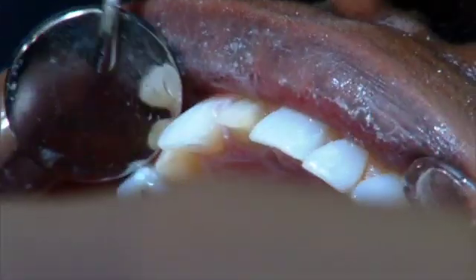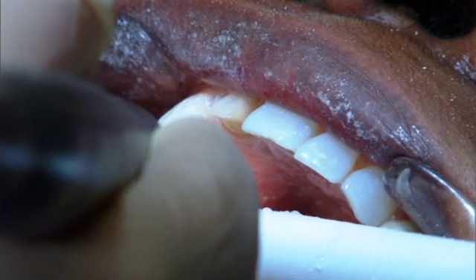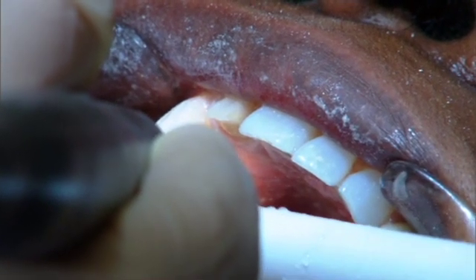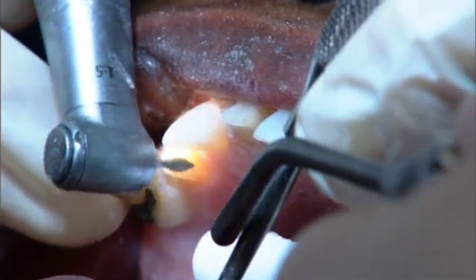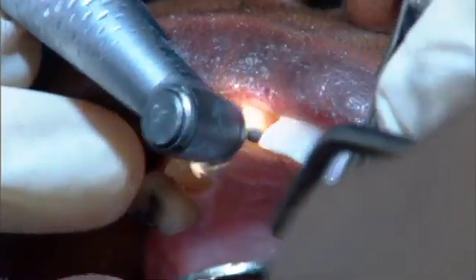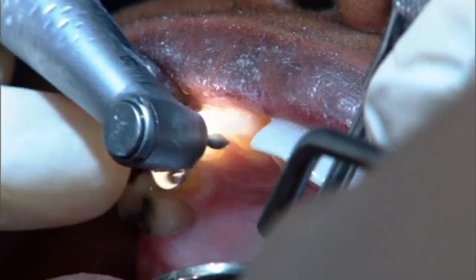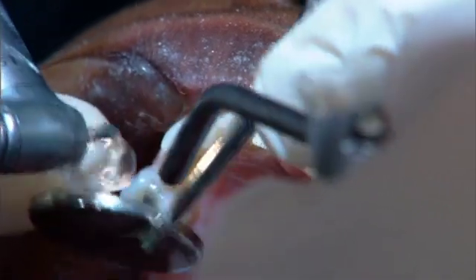Just moving the burr side to side. You can let that shank of the burr serve as your guide. There again, we got to find some room for probably some lingual ledges, to be able to build our major connector with our partial.